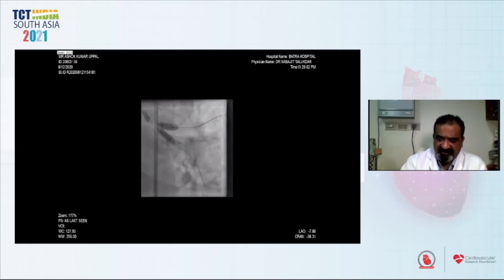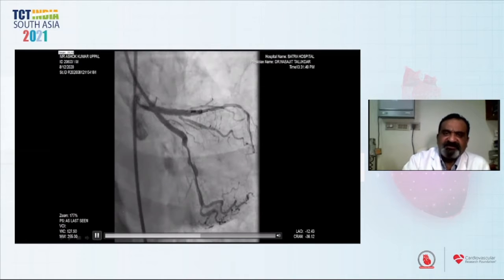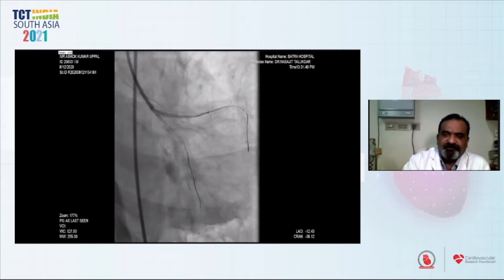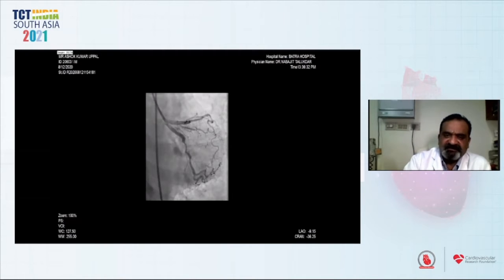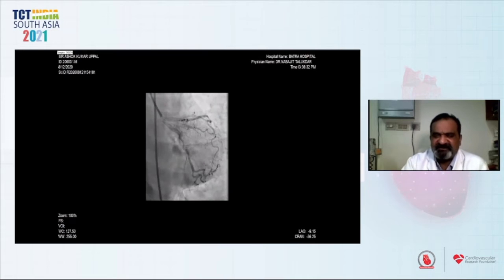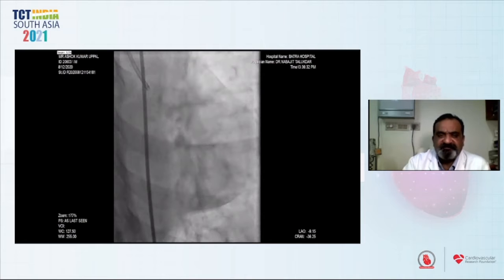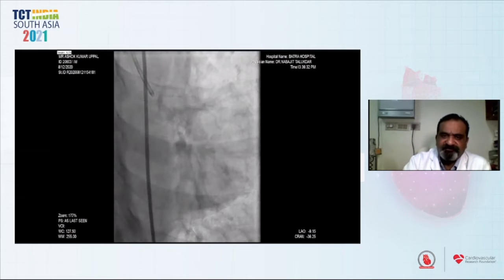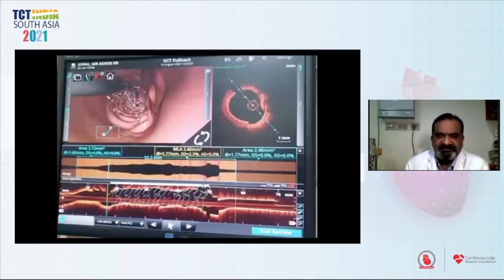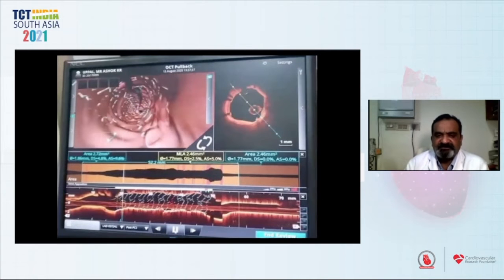We took care so that balloon overhang didn't come into the LAD-left main junction, and we used StentBoost technology to the fullest extent. Here is the post-dilatation and the final step. After post-dilatation, we could see decent results and decided to go for imaging. This is the final result. The distal circumflex is not too good but it was a stable lesion and we decided to leave it. By now we had used around 80 ml of dye, so we decided not to use too much further. This is the OCT run, which was decent enough and showed a well-apposed stent.